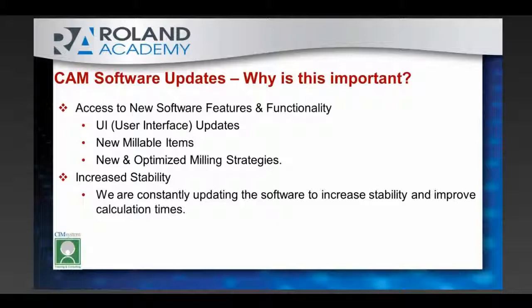When you pay for that maintenance update, it doesn't only get you new features in the software, it also gets you fixes to older problems, as well as better functionality within the software in terms of processing times and things along those lines.